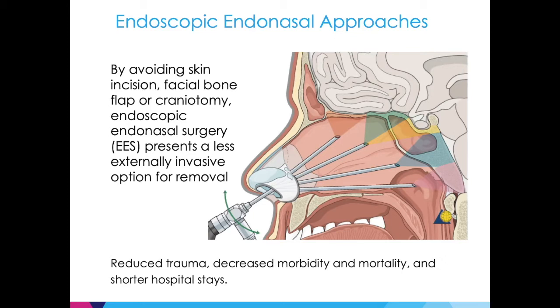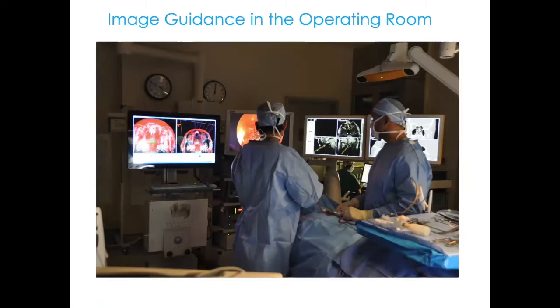It's minimally invasive, and all of the surgery is performed through the nasal passages. Now, MRI is very important in this whole process to plan the surgery and to guide the surgery while it is happening, because the camera view is just a pulpy mess.